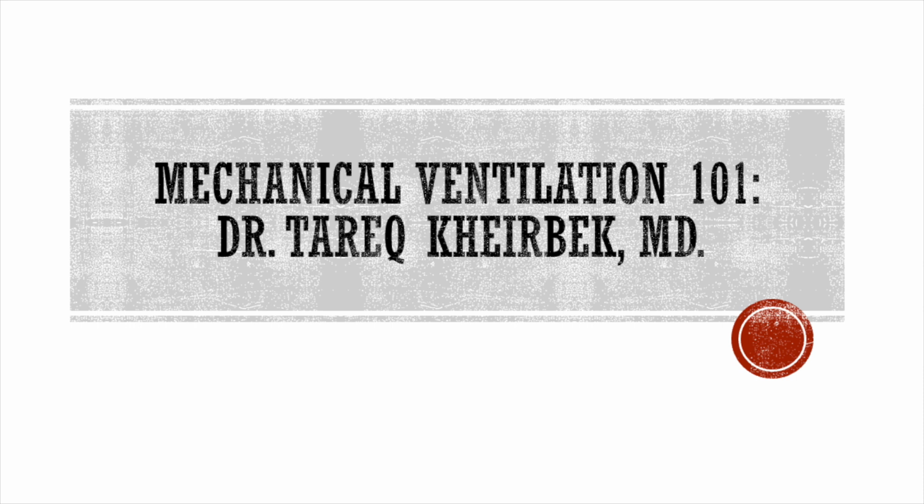How do we set up vent settings? I think that's a question that especially novices or interns find themselves in the position where they get a patient from the operating room and they have no idea what the respiratory therapist is putting the patient on. So commonly when you review ventilator settings, you will see us talk about four major parameters on a ventilator. There is FiO2, or the fraction of inhaled oxygen. There is the PEEP, positive end-expiratory pressure. Respiratory rate, the one that you set on a ventilator, which is different sometimes from the one that the patient breathes. And then there is a driving pressure or a tidal volume.